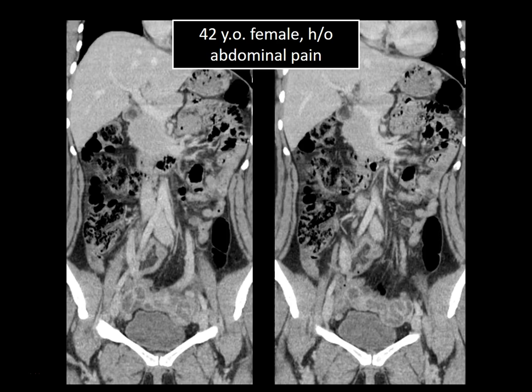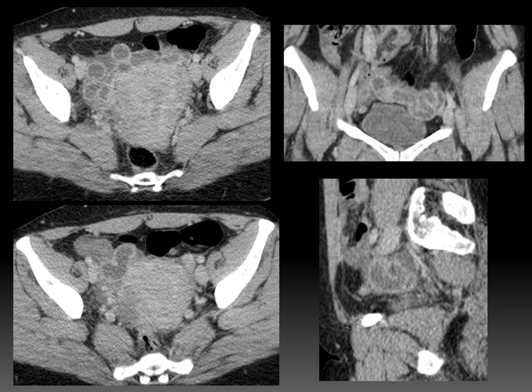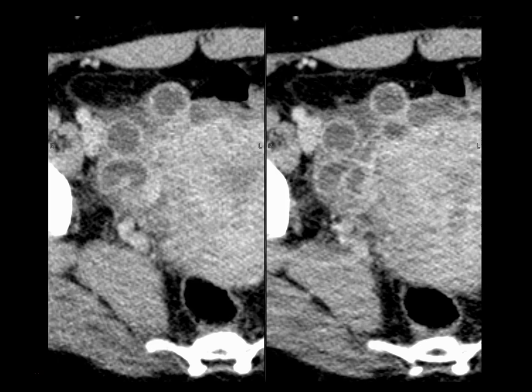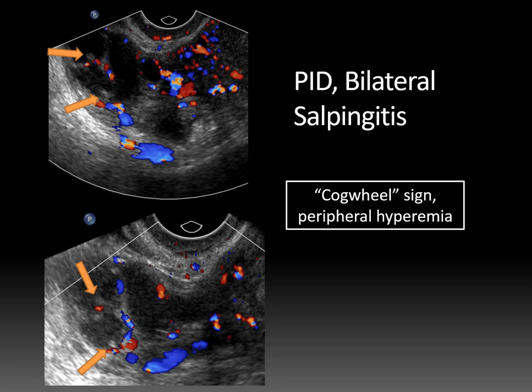Here's an example of how the cogwheel sign can help you. This was a patient who came into the emergency department with abdominal pain. You can see tubular fluid-filled structures in the inferior pelvis on this coronal reformatted CT image — you may initially think this is bowel. Looking at the axial and sagittal images, you can identify S and C shapes. Coning in further, you can see little nodules on the internal component of the tube, indicating the thickened longitudinal folds of the cogwheel sign. On ultrasound, the cogwheel sign again indicates tubular inflammation, with peripheral hyperemia on color Doppler. This was a patient with PID and bilateral salpingitis.